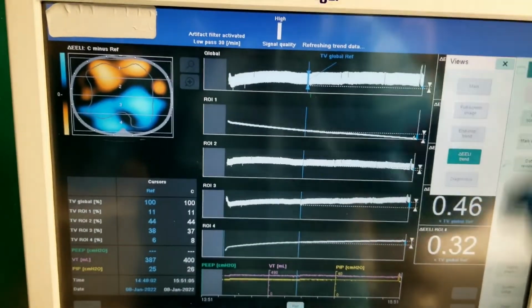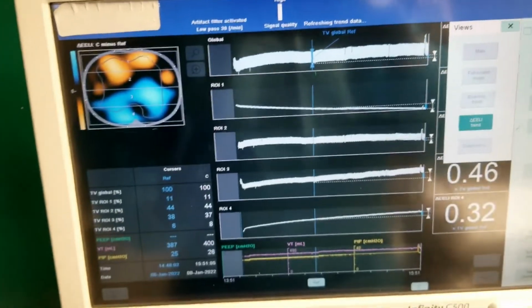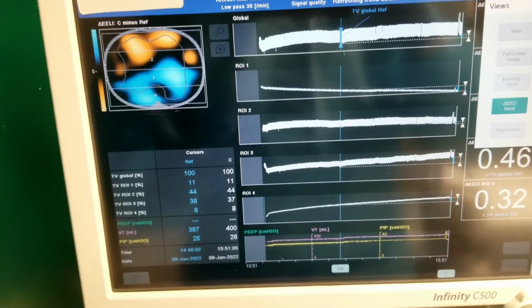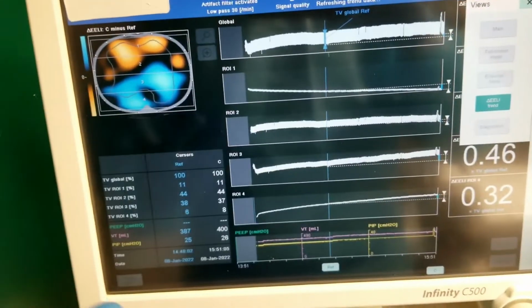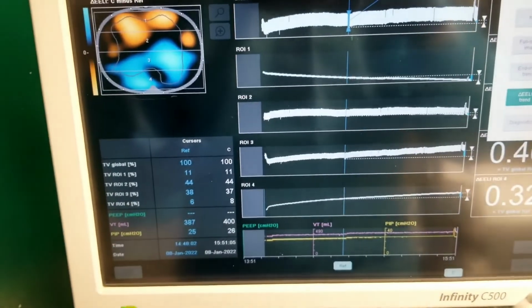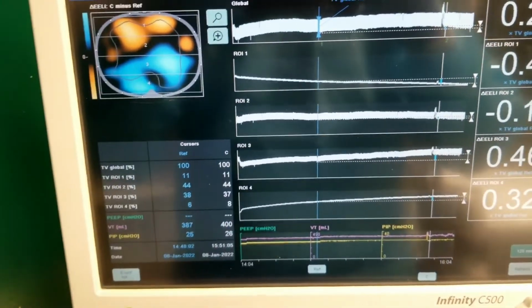This guy here. Even though there's no studies, we're really not going blind. In fact, I'm staying hours at the bedside, slowly adjusting 1 P high at a time, waiting for time, getting measurements. I'm not doing this blind.